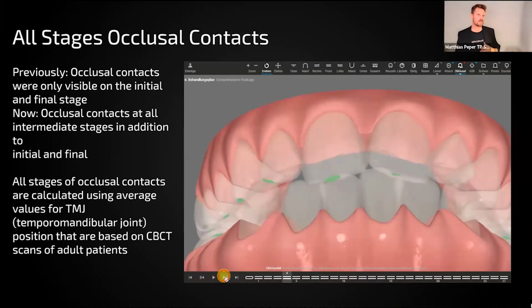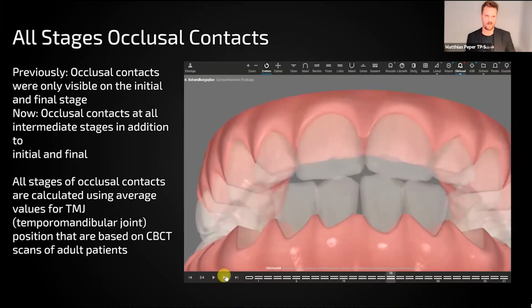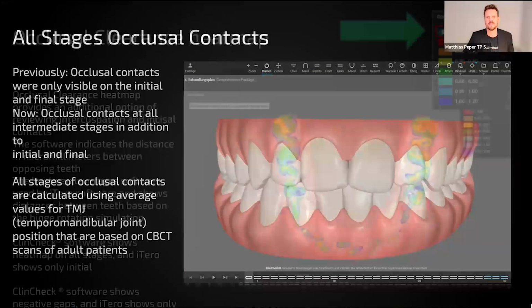These are just examples of how we can program the software in a better way and do the movements differently. That really helps us create very predictable movements and end up in better situations.